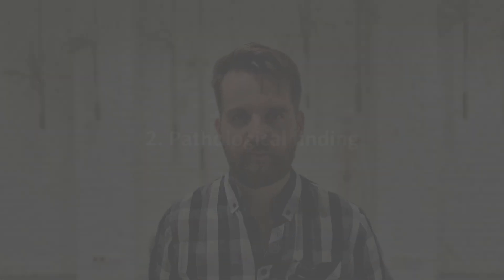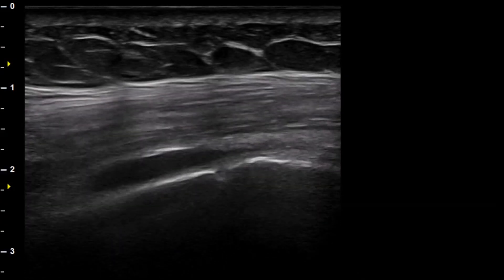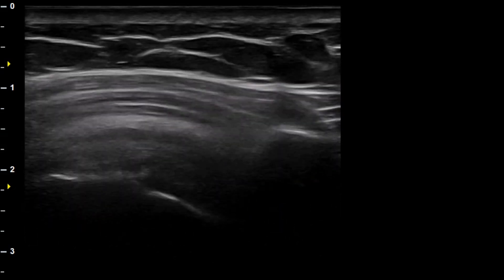Pathological finding: In a pathological case, the bursa becomes visibly distended with a possible teardrop shape at the distal end, extending further between the humerus and the deltoid muscle. This abnormal appearance often indicates bursitis, which can lead to shoulder pain and restricted movement.